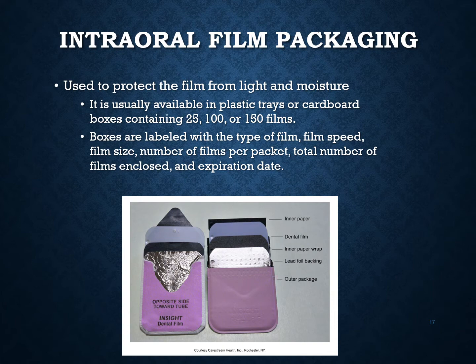And so what we see here is this outer package. We see the lead foil backing, and then we see this paper wrapping. The dental film sits inside this paper wrapping. It goes kind of underneath it, and so that one side is a little longer. So when you open it and you grab that little paper part, you can pull up on it and it'll actually pull the film out for you.